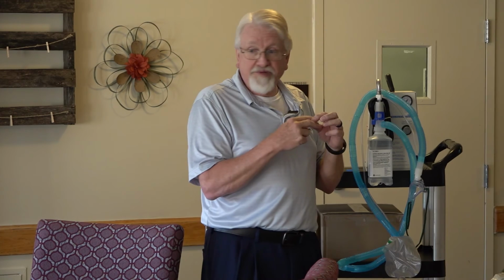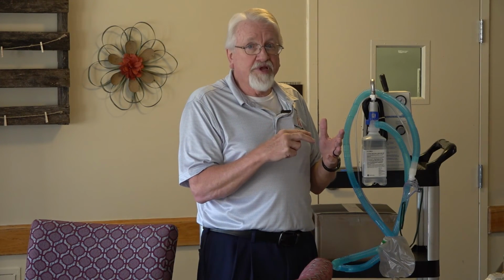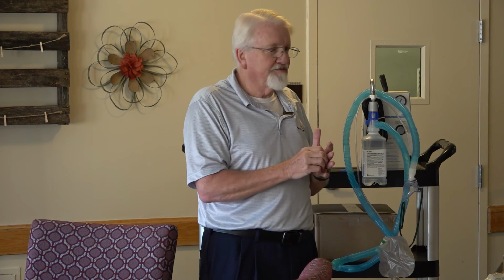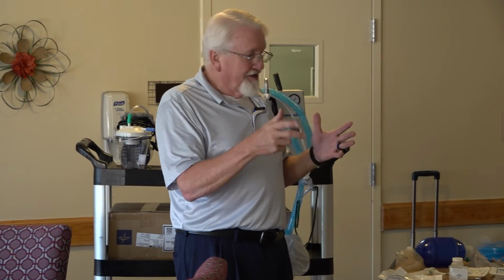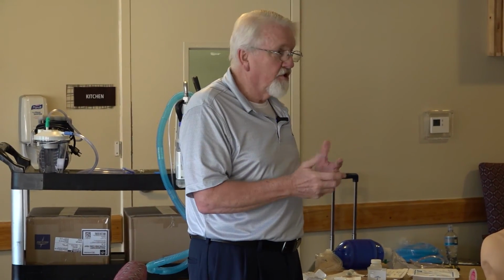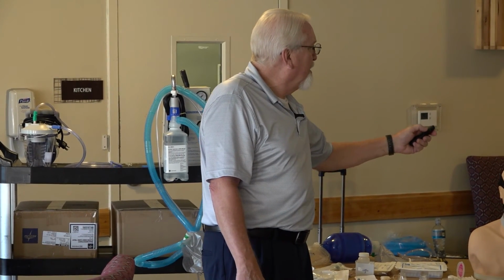Sometimes those can be extremely tricky, but you make sure they're in place. If they're not, you're going to have a leak once you turn that thing on. Then you will tighten up, open, and set your flow accordingly to what you need.